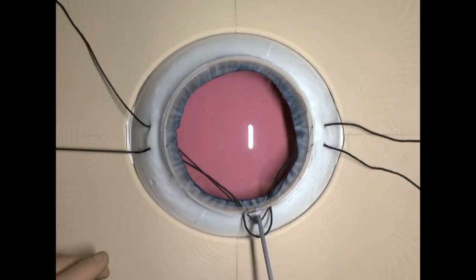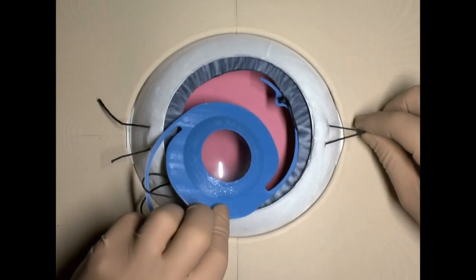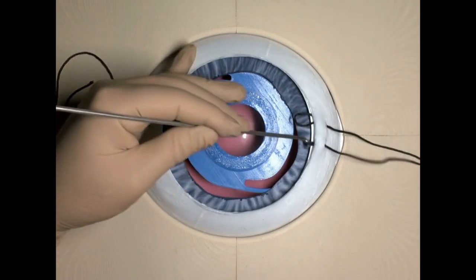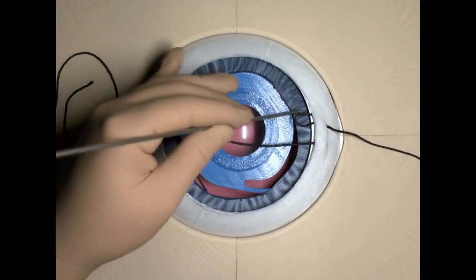We can lead one or two sutures inside the eye. The haptics are fixated by a knot, as in a model, or by a loop. In this case, the sutures are tied under flap constructed from limbus.